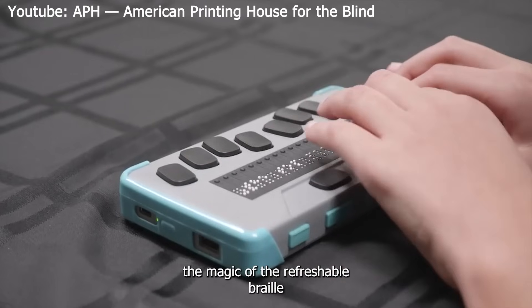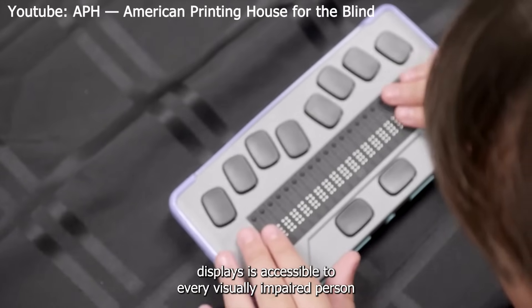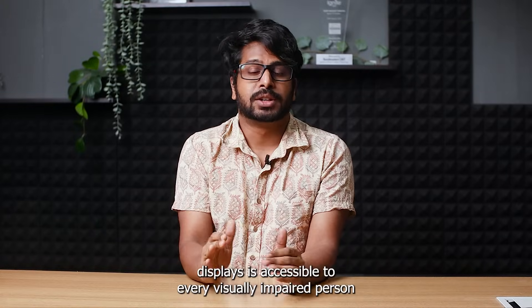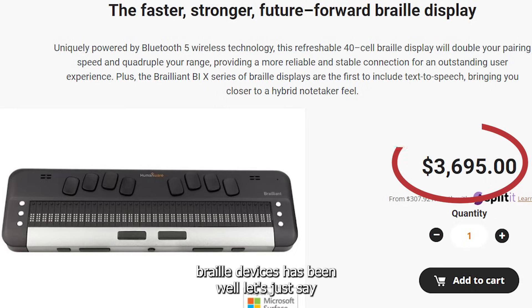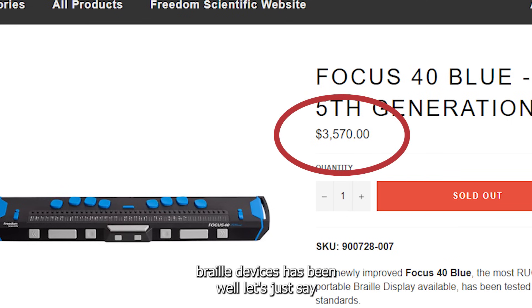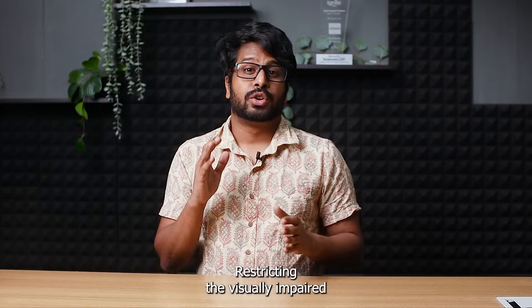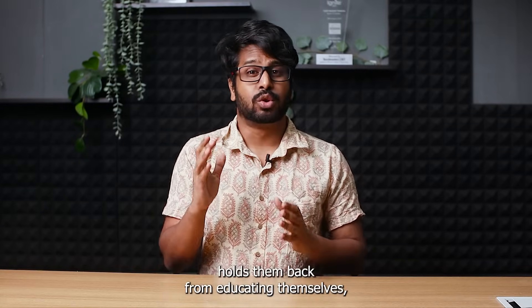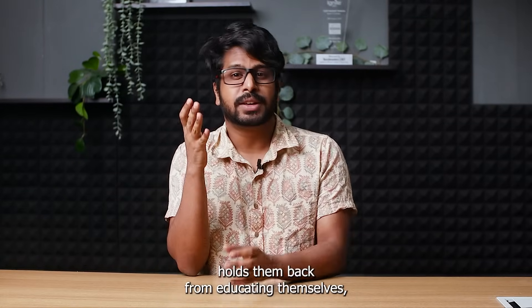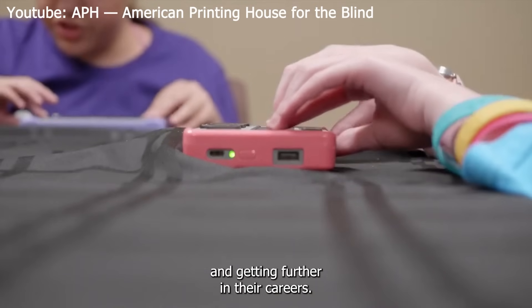I imagine a world where the magic of refreshable braille displays is accessible to every visually impaired person without breaking the bank. But for years, the cost of refreshable braille devices has been not very pocket friendly, restricting the visually impaired from accessing such an important technology — holding them back from educating themselves, accessing digital literature and getting further in their careers.